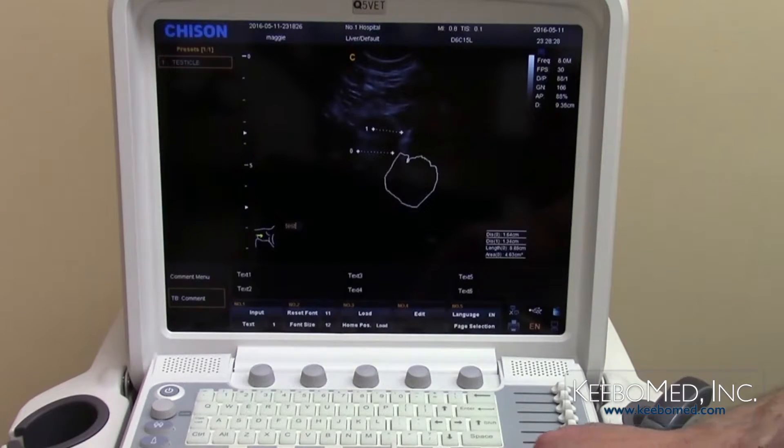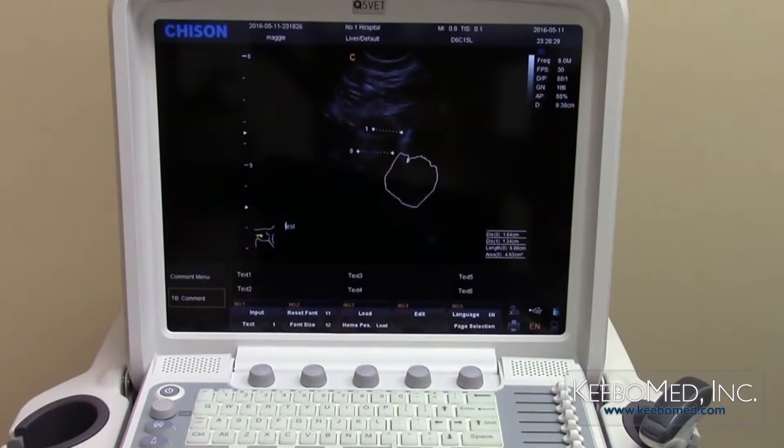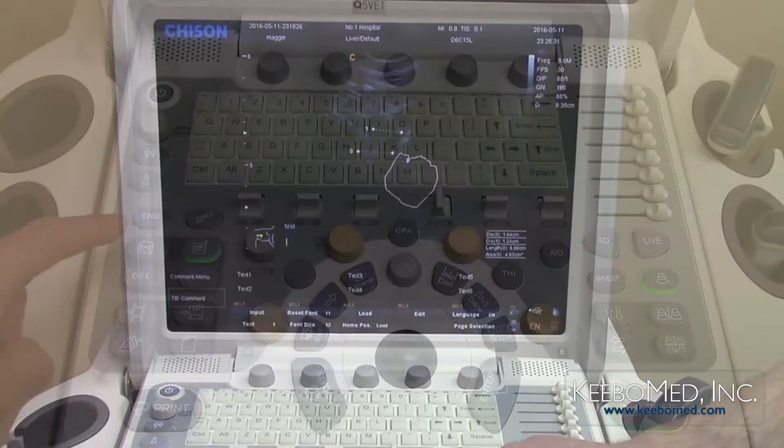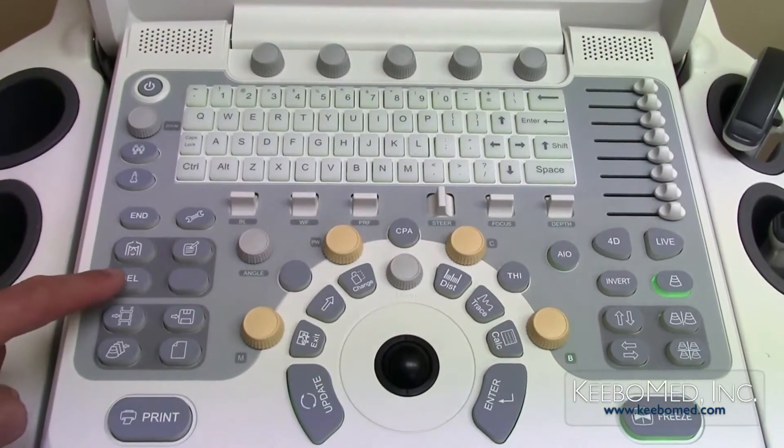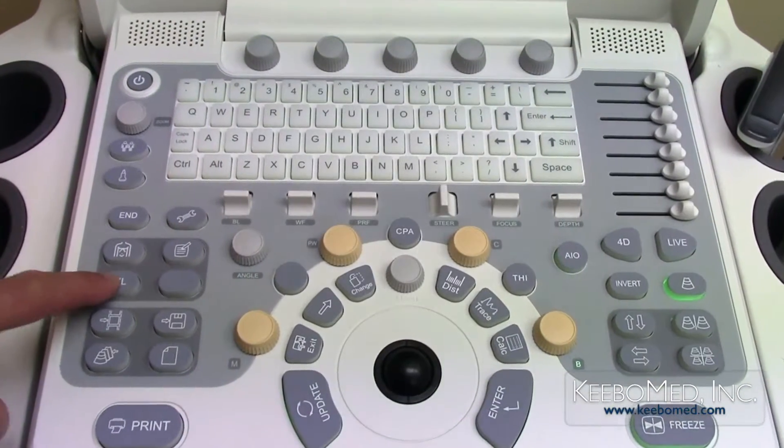To delete measurements, notes, or body marks on the image, simply press the delete button.